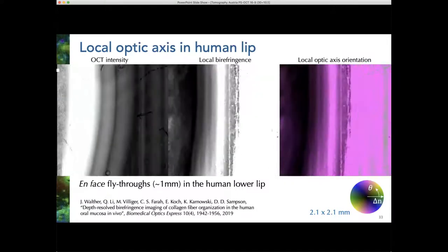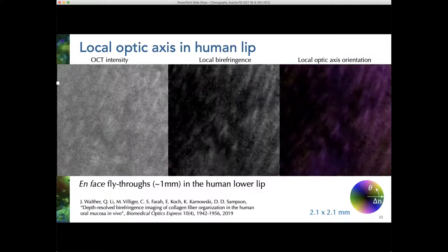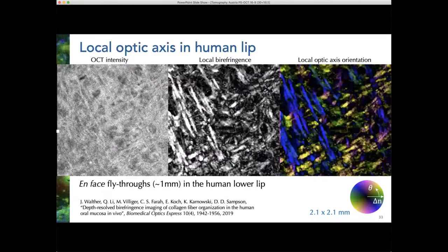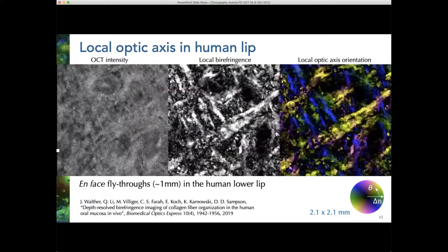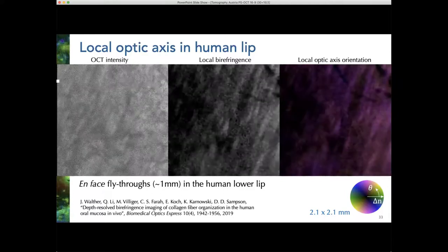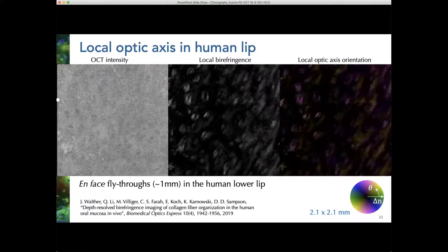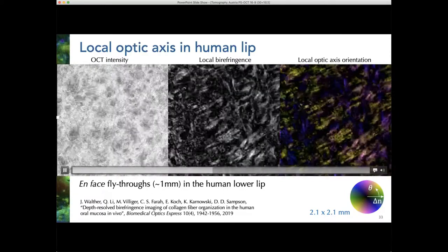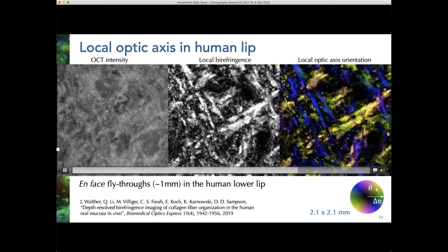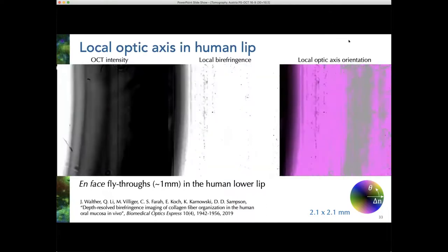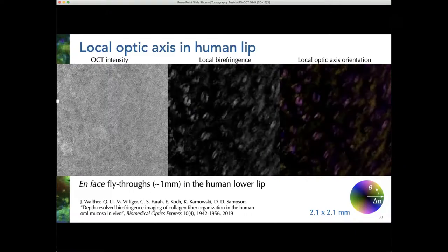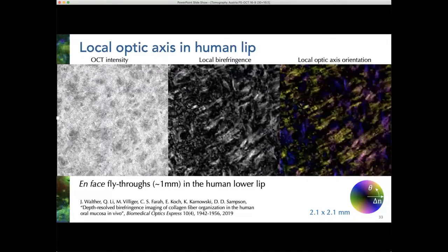This shows the same thing but flying through the whole millimetre or so of image — starting from the cellular surface and working into the fibrous tissues. This gives you a sense of the quality of data you can generate over a whole millimetre. Local birefringence is shown in black and white and local optic axis here, bringing out the patchwork pattern in the collagenous structures within the lower lip.